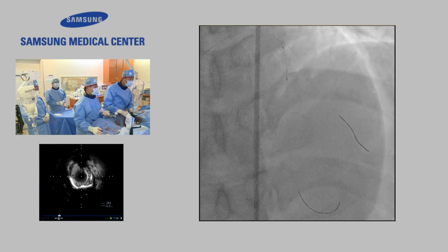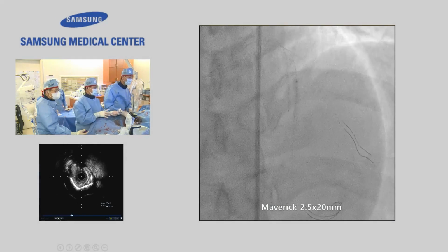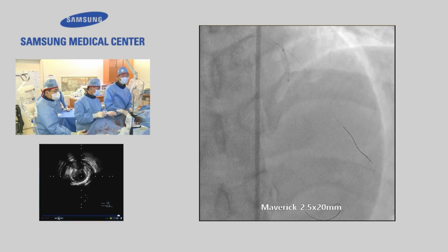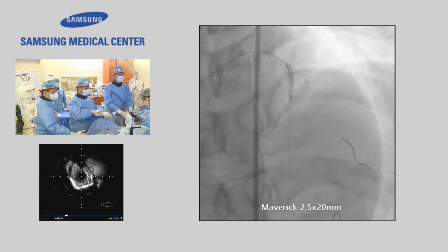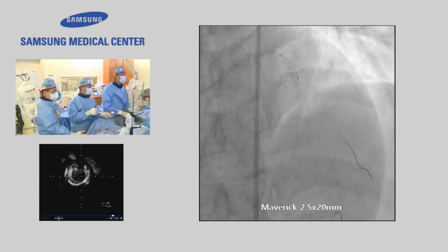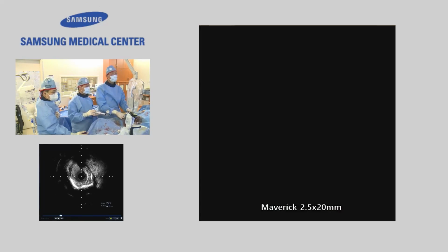How many minutes do I have? Inflation? Deflation? How much time do I have? One minute, okay. So I will try to put the two-stent technique in one minute. Inflation. Okay, deflation.